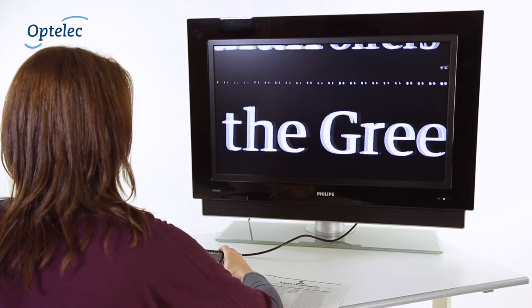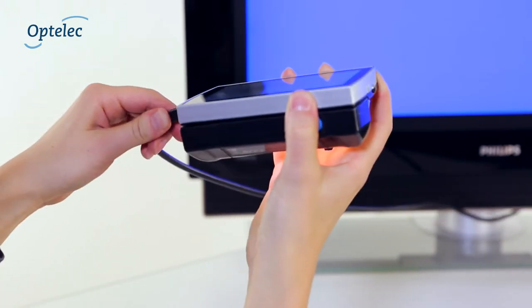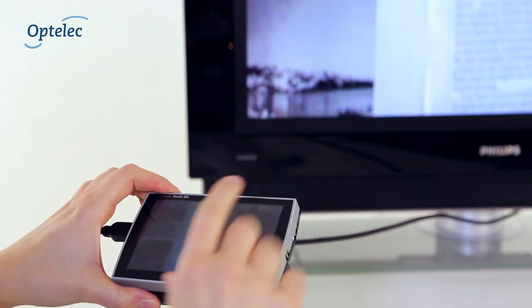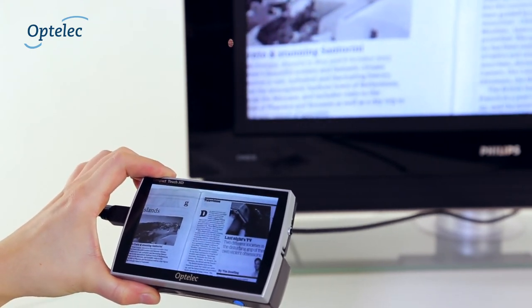Do you want to view bigger images on a large screen? The Compact Touch HD can connect to any external monitor or TV with an HDMI or an RCA input, cables included.